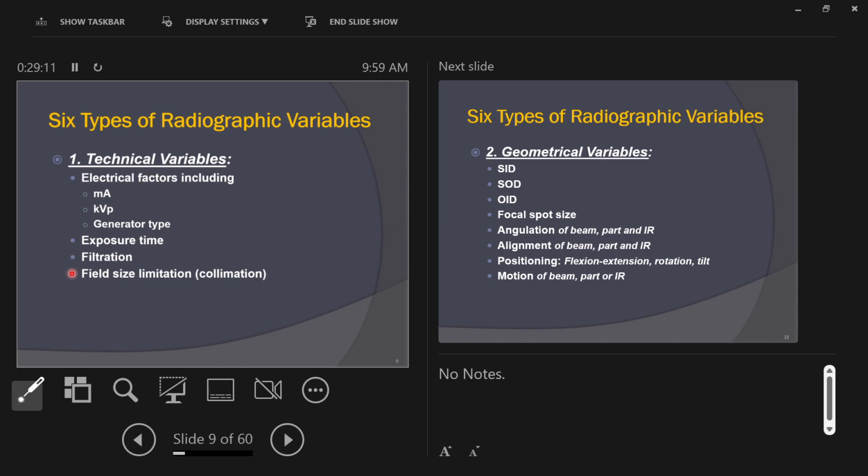To give you something to grasp onto for that, your collimated field must never be larger than the size of your cassette. So if your cassette is a 10 by 12 cassette, that's the maximum size for your collimated field. It should always be smaller than that though.